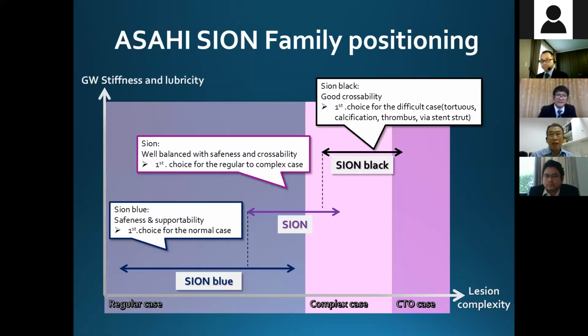But in a stent, we know well that the stent surface has been polished very well, and it is almost very safe to cross the fragile artery. So for the artery wall, they would not be harmful. So why would the polymer jacket coat be harmful?